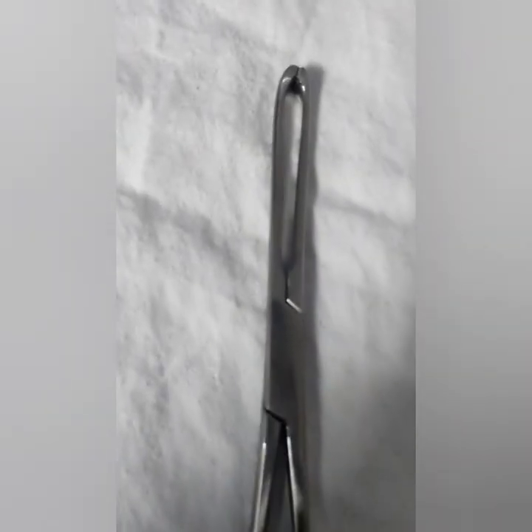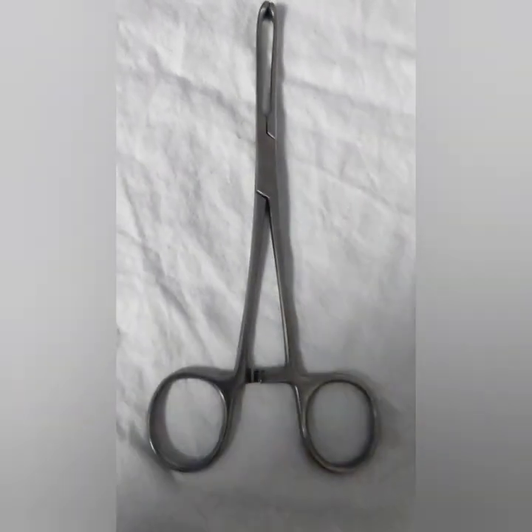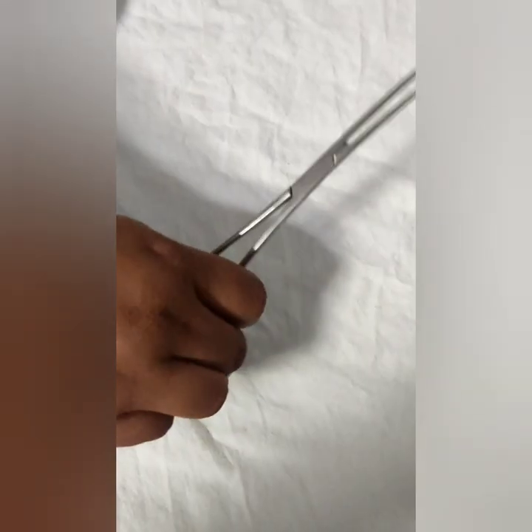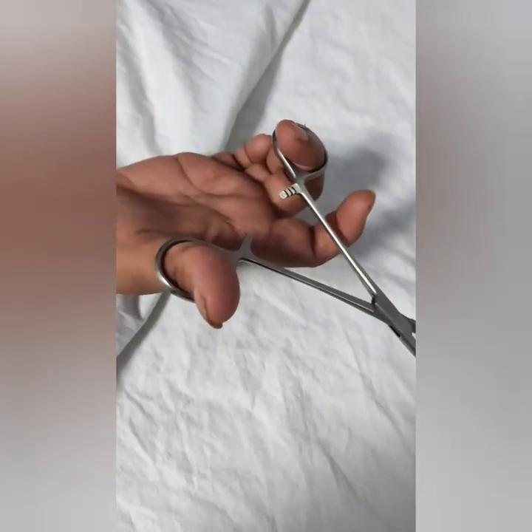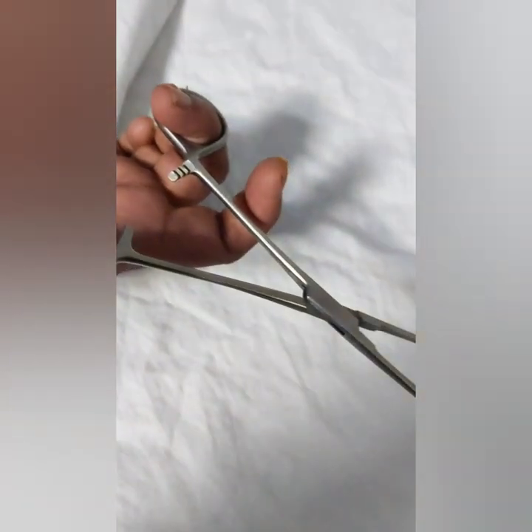Alice forceps is a surgical instrument used by the surgeon to hold or grasp heavy or dense tissue and slippery organs during surgery. It is also used to grasp fascia and soft tissues such as breast or bladder tissue. Alice forceps is also used to grasp the cervix to stabilize the uterus, such as when an intrauterine device is being inserted.